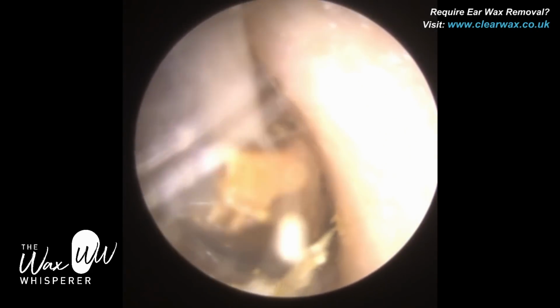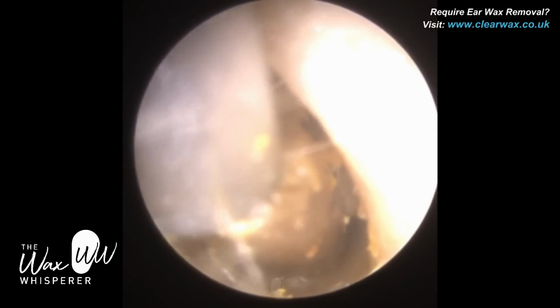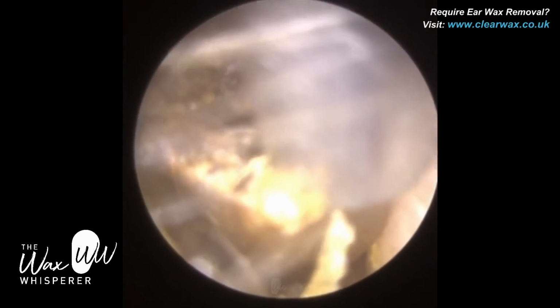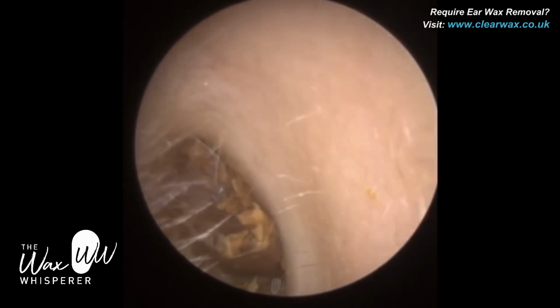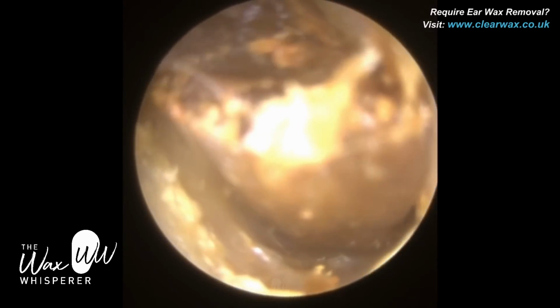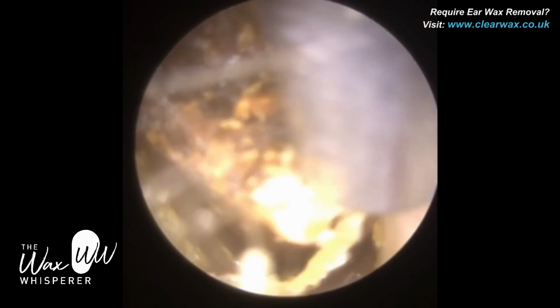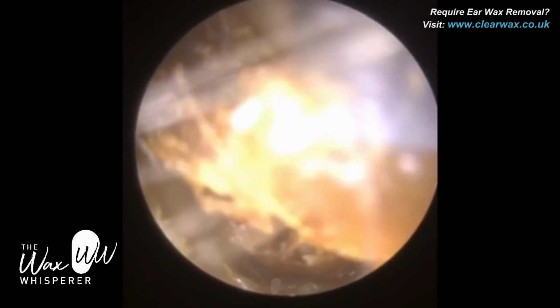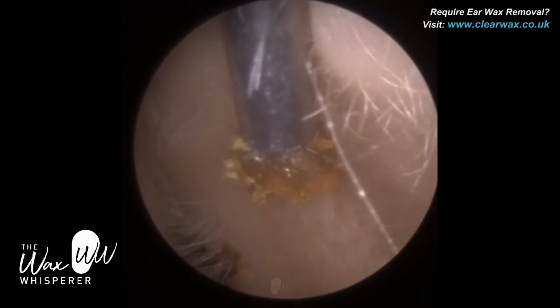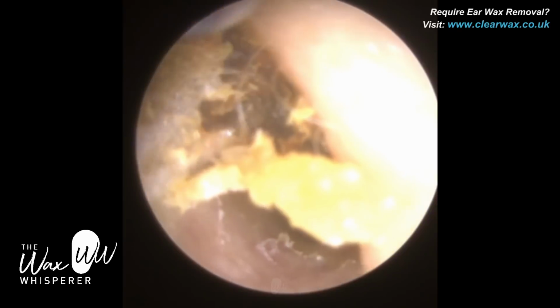So I'm just trying to bring this wax forward laterally. You can just about see some of the cilia, the hair, so we know we're near the outer part of the ear canal. Because it is narrowed, it is kind of plugged in there, so it's a bit of a wriggle. I may have put some olive oil drops in just to loosen this, which we'll see in a moment.